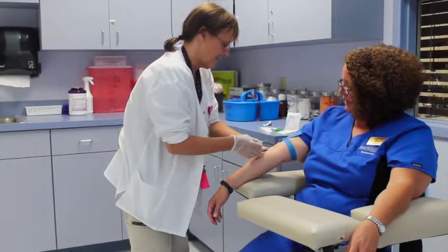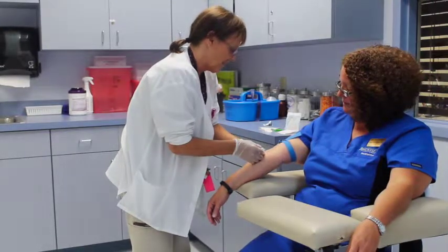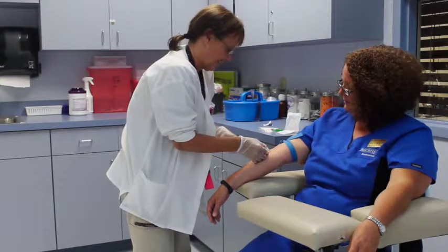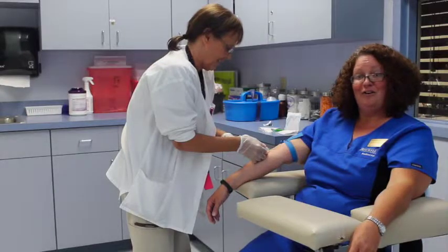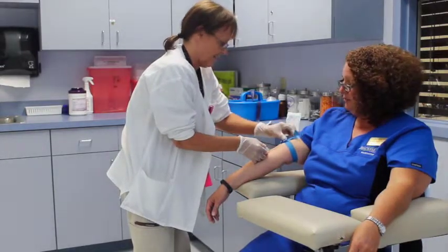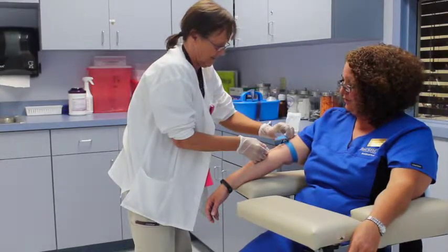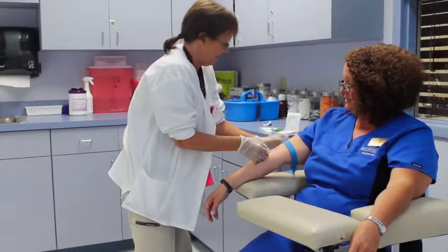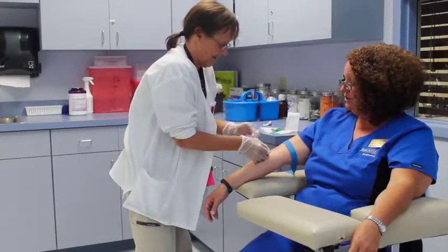As you're putting in the needle, it needs to be beveled up. You always want to keep your eye on that needle at all times so that you're not pulling up or pressing down, not pushing forward or pulling back on the needle. You always release the tourniquet prior to taking the tube out.